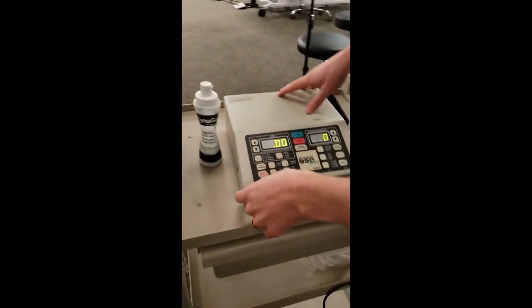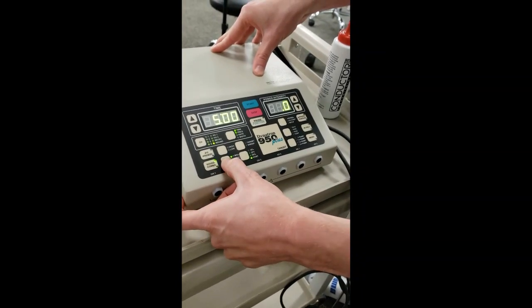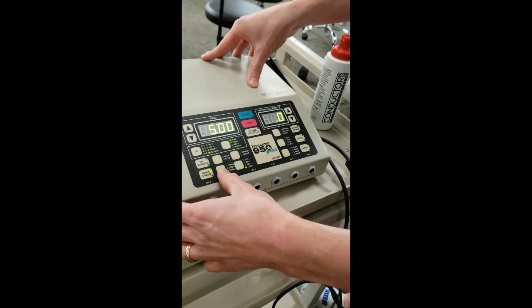Okay, so I have Ronnie comfortable here on the table, and I'm just going to show how to set the parameters on the ultrasound machine. Okay, so there's an ultrasound button in the corner here. You're going to press that once. This type of therapy is going to be mostly superficial. I'm just going to need to penetrate about 1 to 2 centimeters deep. So I'm going to go to 3 megahertz.